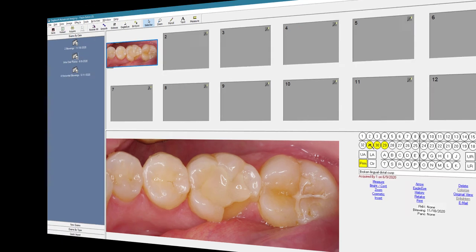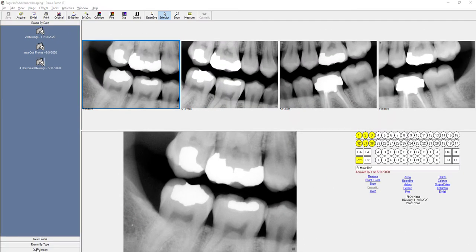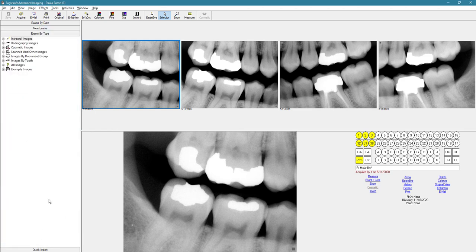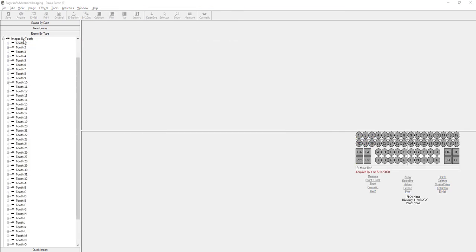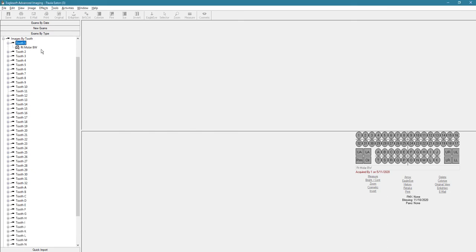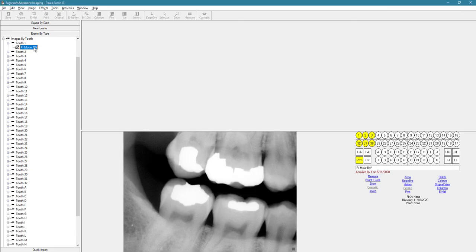You can also search images by exams by type. So for example, if you're looking for just images for a particular tooth, you can expand the images by tooth selection, and then expand even further, and it will show you if there were images of those teeth.